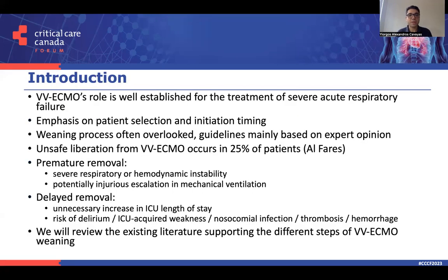VV-ECMO's role is well established for the treatment of severe acute respiratory failure. However, the emphasis so far has been put on patient selection and optimizing initiation timing. The weaning process, on the other hand, has been mainly overlooked. Guidelines on weaning are mainly based on expert opinion.